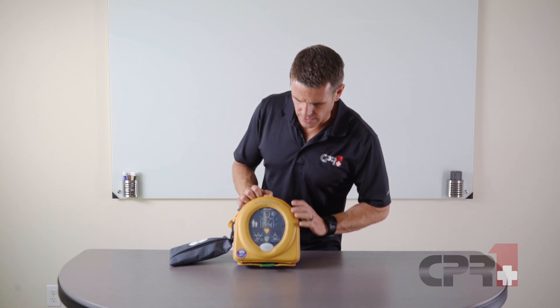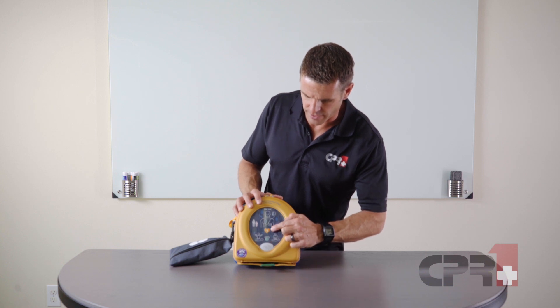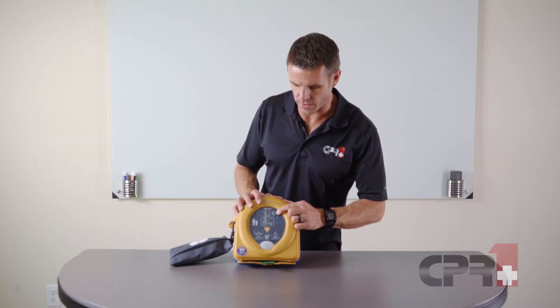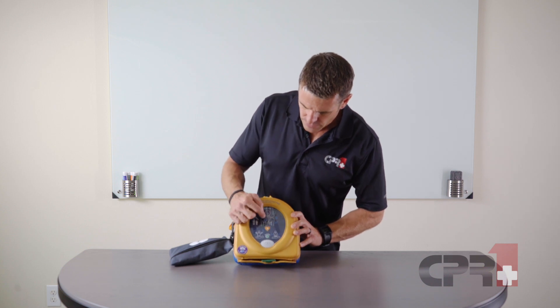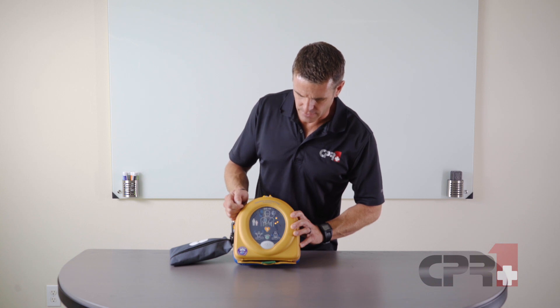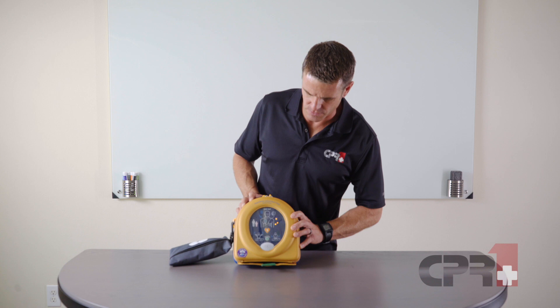On the front, you've got the on/off button prominently placed there, the shock button is just above it, and the readiness indicator flashing green up here in the corner. When you turn on the unit, it's going to show you the location of the pads, where to place those pads, and it shows you those arrows of where to place the pads as well.